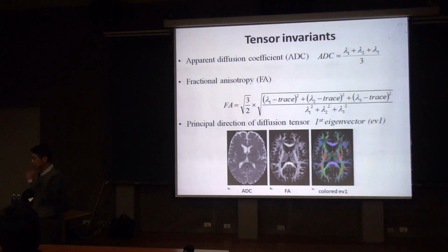So what's the role of blood vessel here? I mean, blood vessel is also a restrictive tube for water. Right? So will the signal mix with blood vessel? Yeah. In the diffusion sequence, actually the signals from inside the blood vessel are all gone.